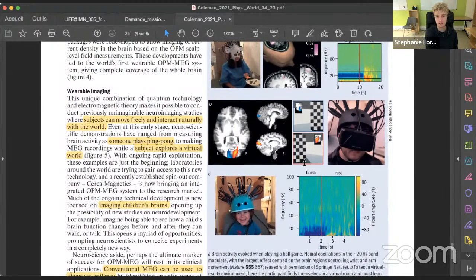So they are saying that it's still very sensitive to motion, but what they do is actually create, if I understand correctly, a headset that specifically fits your head using 3D printing, so that you can have a specific headset for you that will fit you well and will reduce as much as possible any kind of motion that you have. I still guess that you can't shake your head around and stuff like that, but it's still something that is much better than before.